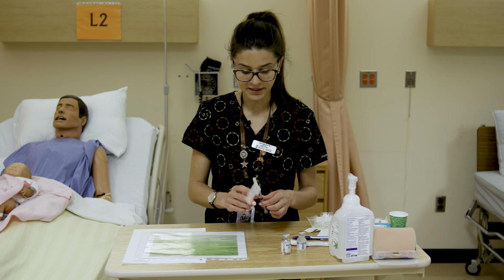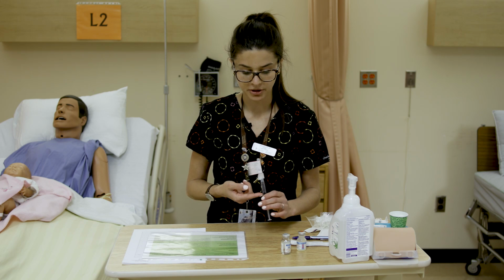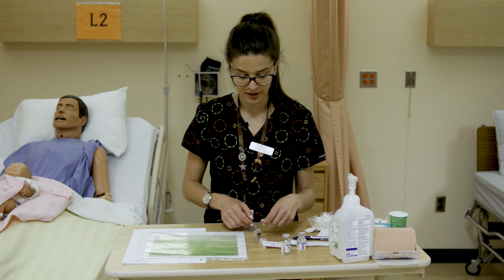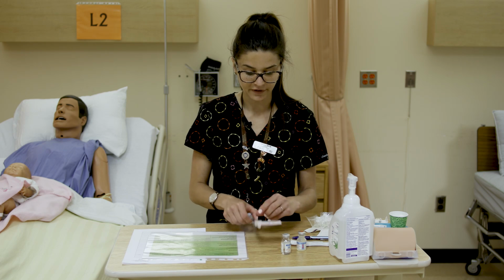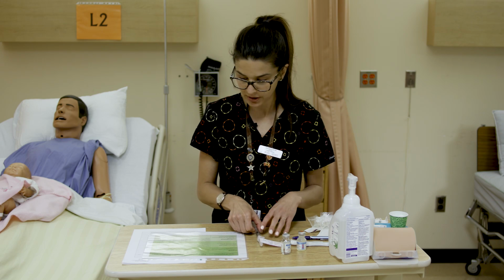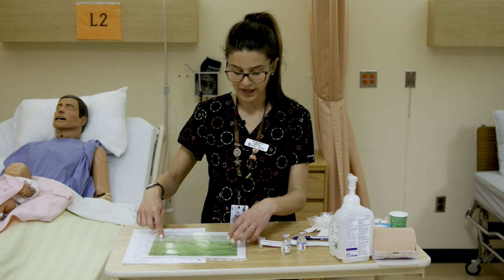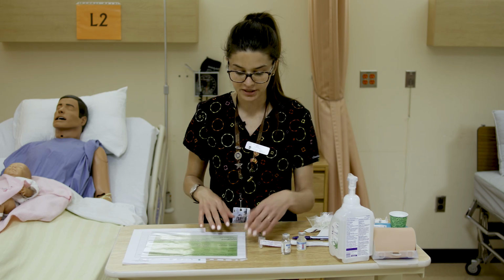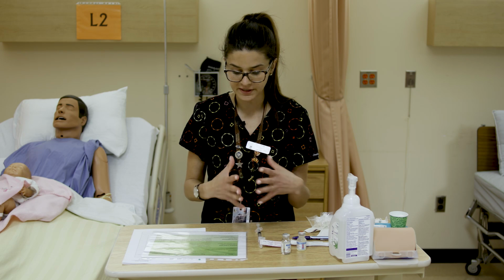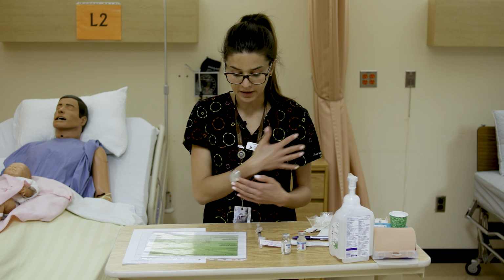And then going deeper into selection of sites, how you choose which site is actually dictated typically by the type of medication and also by the amount that you end up drawing up, so the volume of the medication. So in this case, we calculated to get that 500 milligrams, we needed a volume of 2 mLs. So 2 mLs fits into pretty much every category of injection location. We could do that. Some facilities are okay with you doing up to 2 mLs in the deltoid.